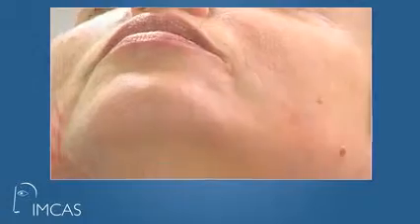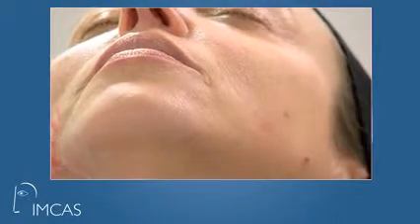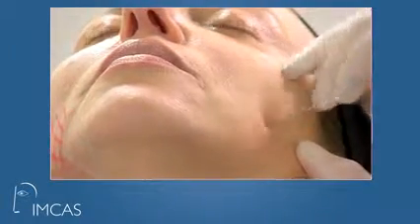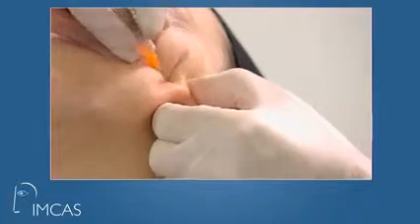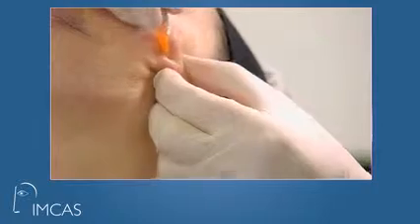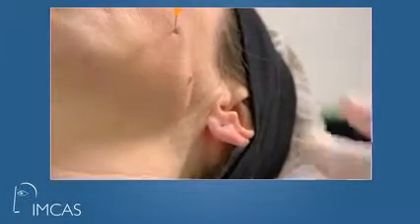Okay, you see? Okay. Now, I will inject the retromandibular area. It's very hot here, and the patient is a little bit... Okay, for the retromandibular area, we have to move behind my entry point. Okay, you can see I have the possibility to be very posterior, okay?